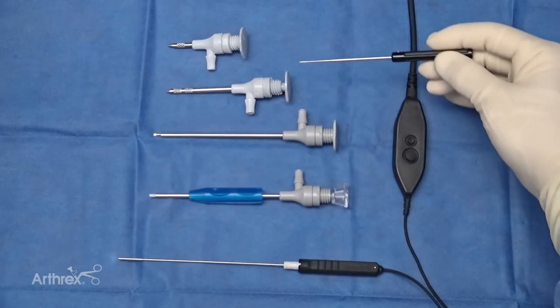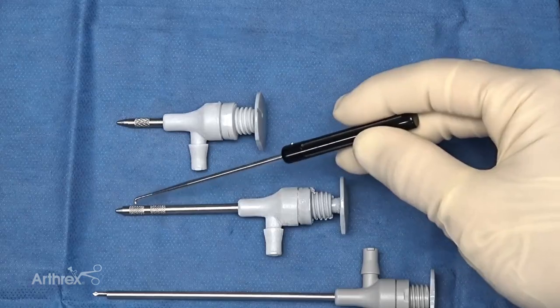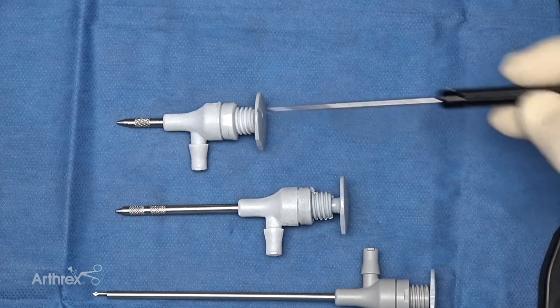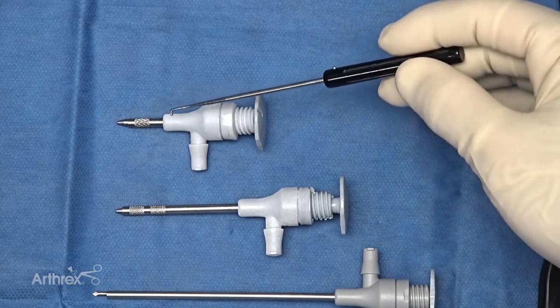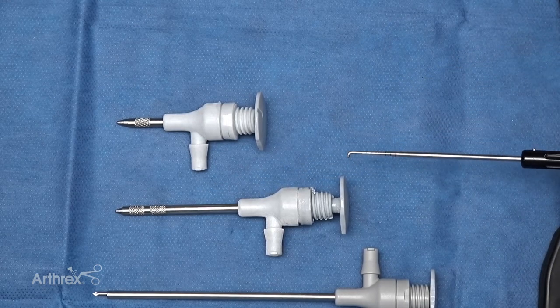We also have new cannulas. These cannulas have a diamond pattern at the insertion, which will help with friction on the soft tissue, allowing them to stay in place as the surgeon is working. We have two different lengths — a shorter one for a smaller joint and a longer one, depending on which joint you're going into and how much length you actually need.